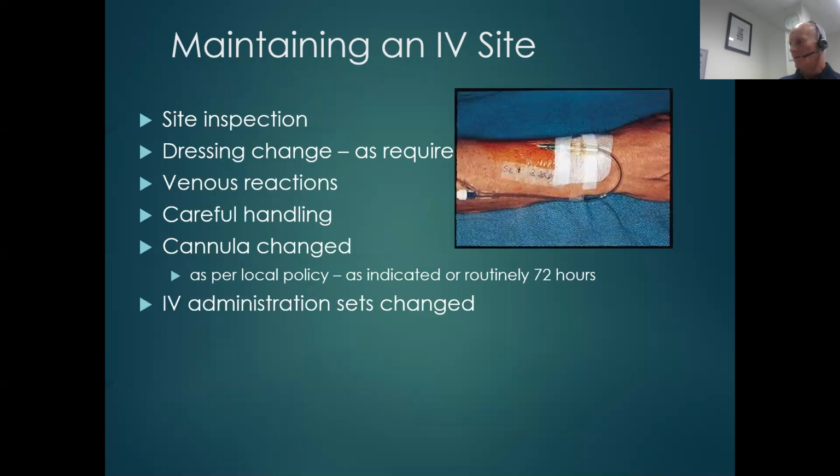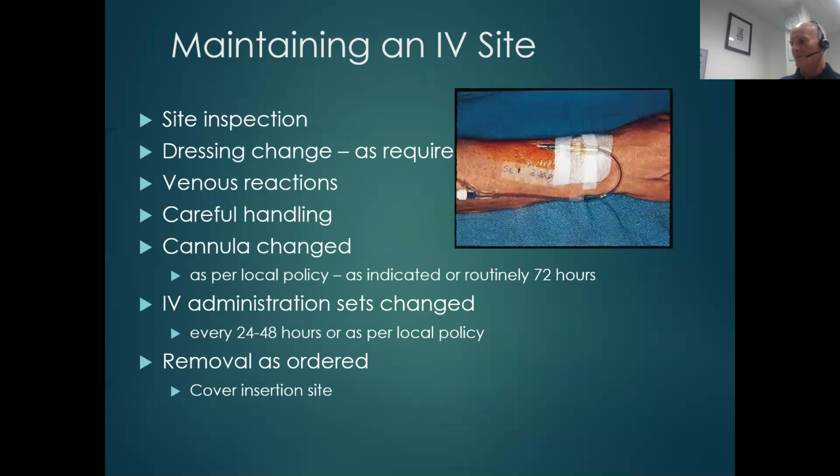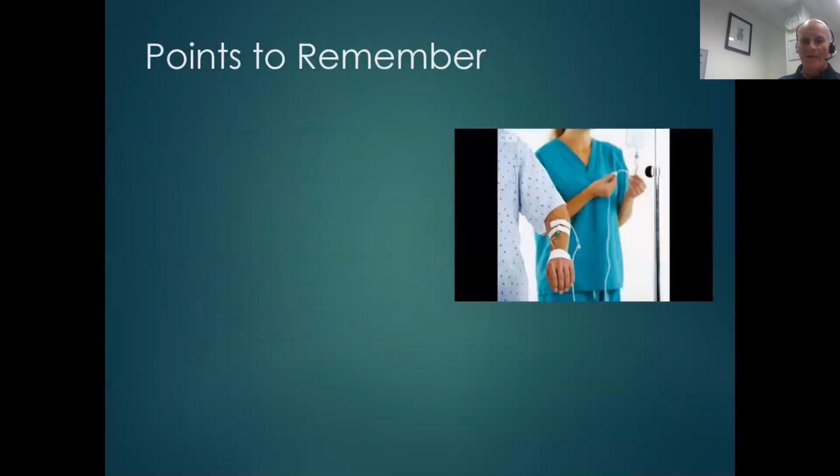IV administration sets change every 24 to 48 hours as per your local policy. Removal as ordered. Cover insertion site. Check bleeding is stopped.